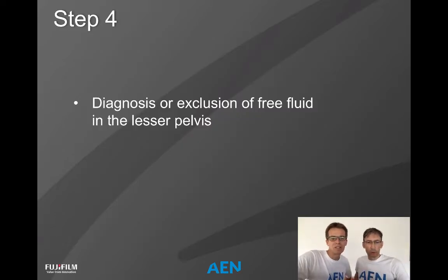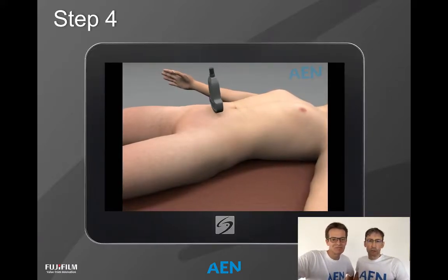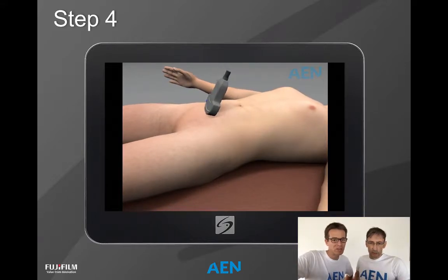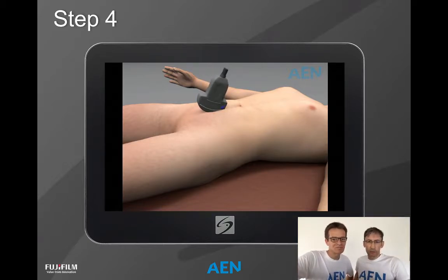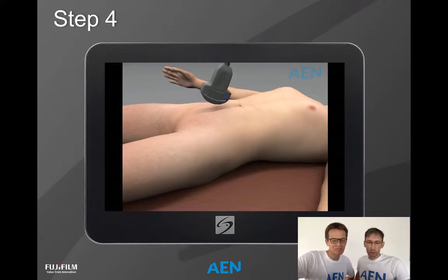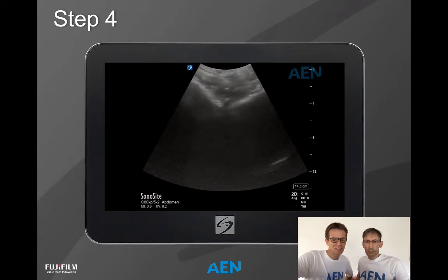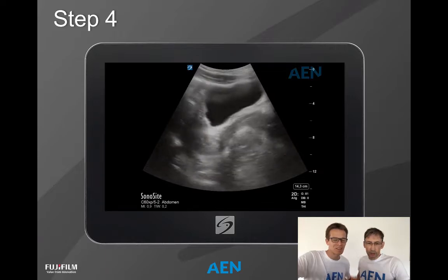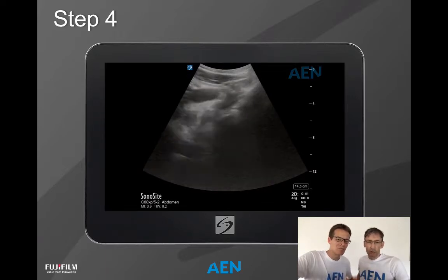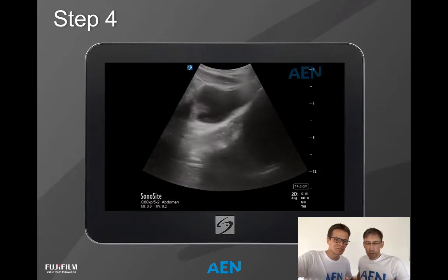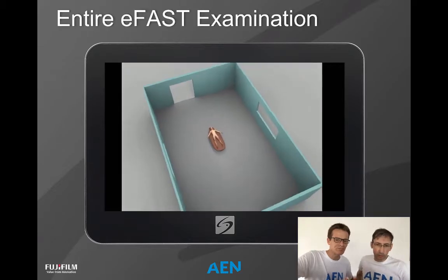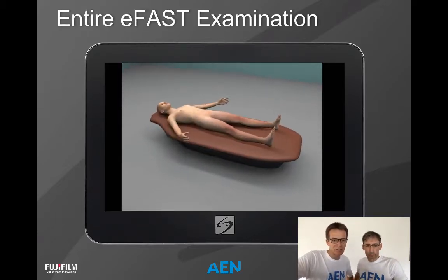Step four is for diagnosis or exclusion of free fluid in the lesser pelvis. We put the probe on the lower abdomen, visualize the bladder, and rotate the probe to get views in two axes for a good impression of the situation, particularly to identify free fluid. The hypoechoic space visible is the bladder, and there is no hypoechoic area outside the bladder — which is very important. So we can proceed to review the entire examination course.